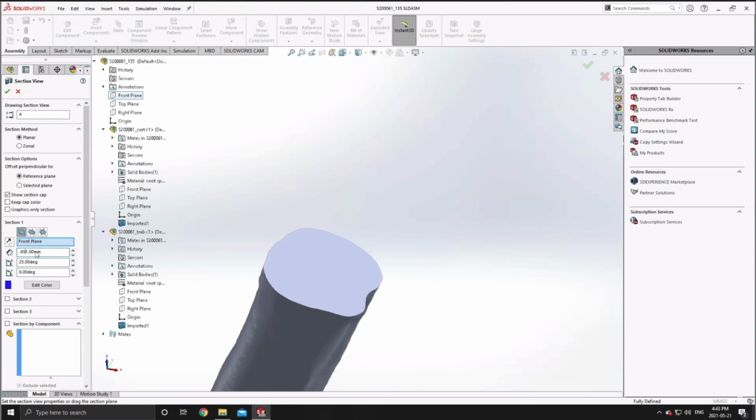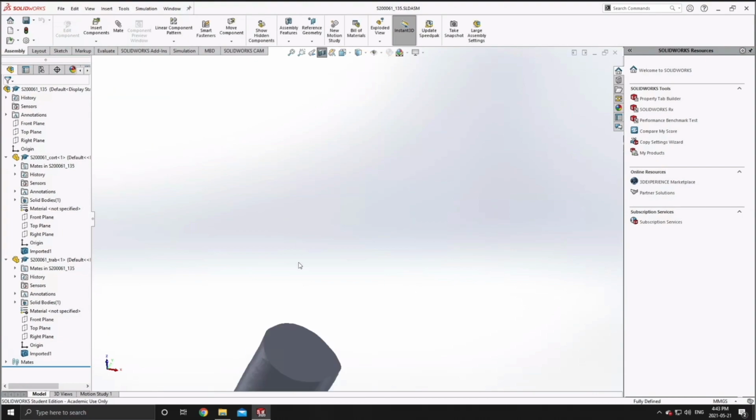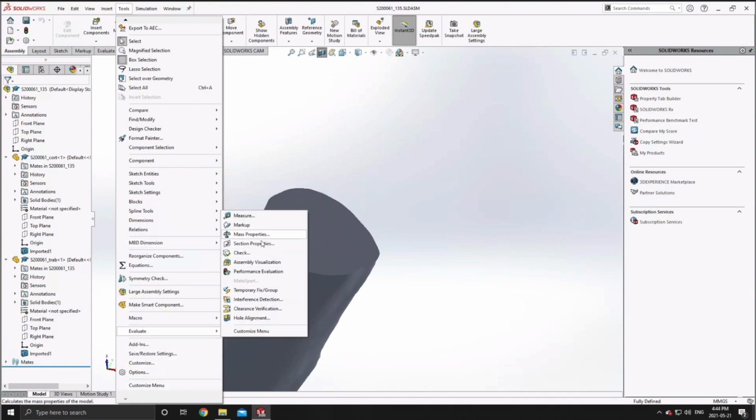Now we'll speed up this procedure in a bit, but if you bear with me here, you can see I just extended my section cut down, or distally, 50 millimeters again in order to develop that second centroid that we're going to use to create the central axis.